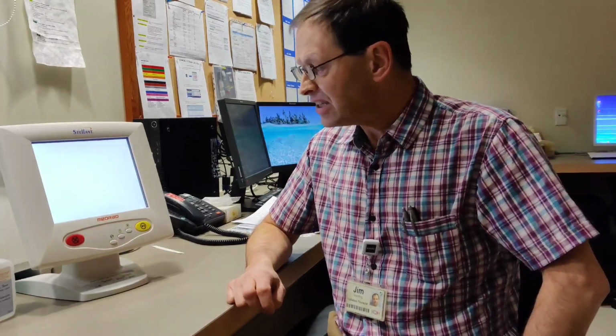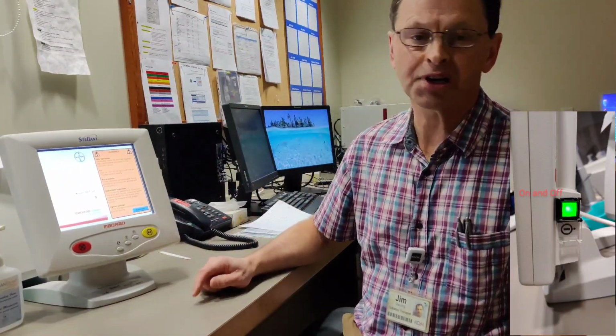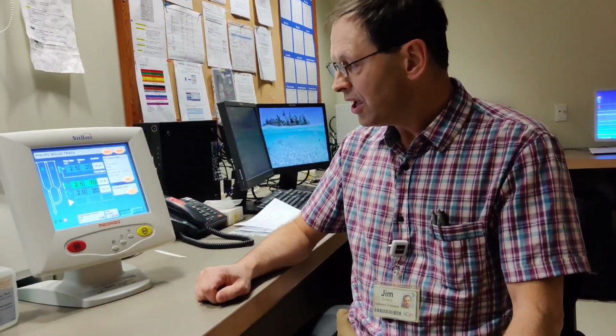And then the next thing you will see is a screen where you have to follow some prompts. So there's some conditions that you're agreeing to for operation. You're going to select continue. Then you'll get to whatever the last protocol was, which by default comes up.